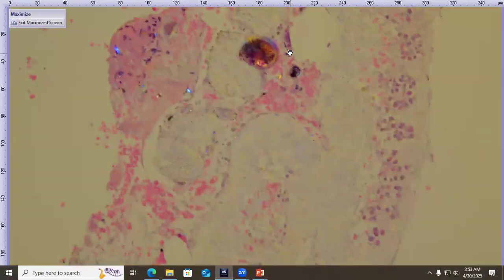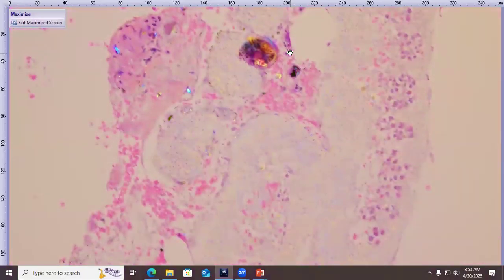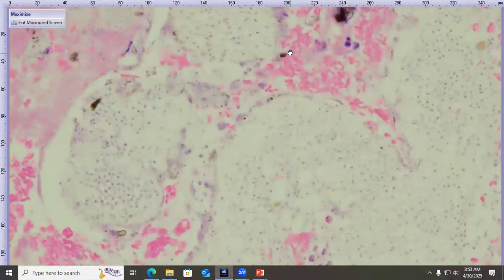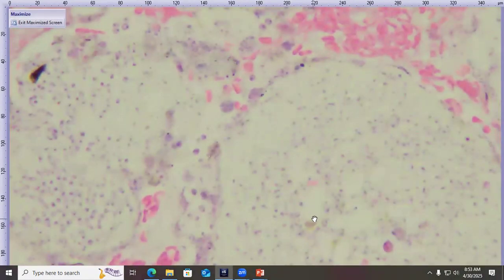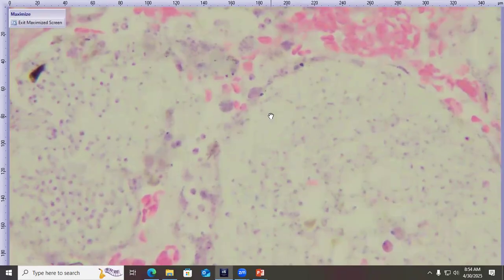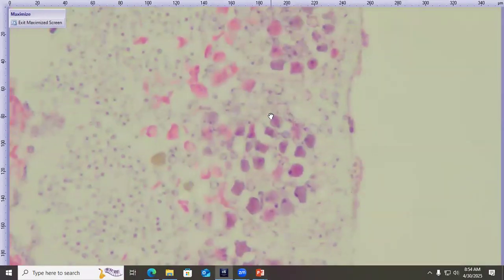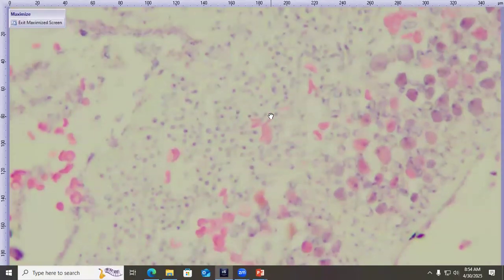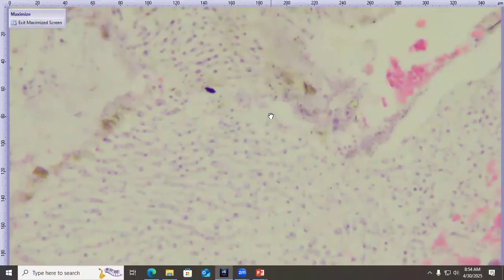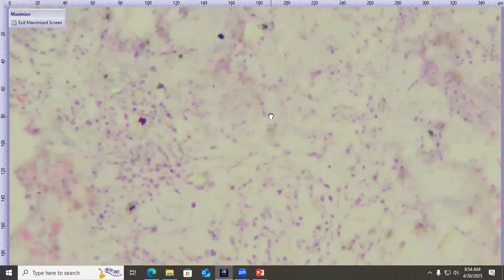So I think that most of this is probably just fungus. Did we get a little bit closer? Oh. And look, we can even go one more closer. So some of it is a little bit pigmented. We've got some conidia and fungal hyphae and just tons of little organisms in here, just hanging out. So despite a pretty dramatic clinical photo, the eye was remarkably not too bad.